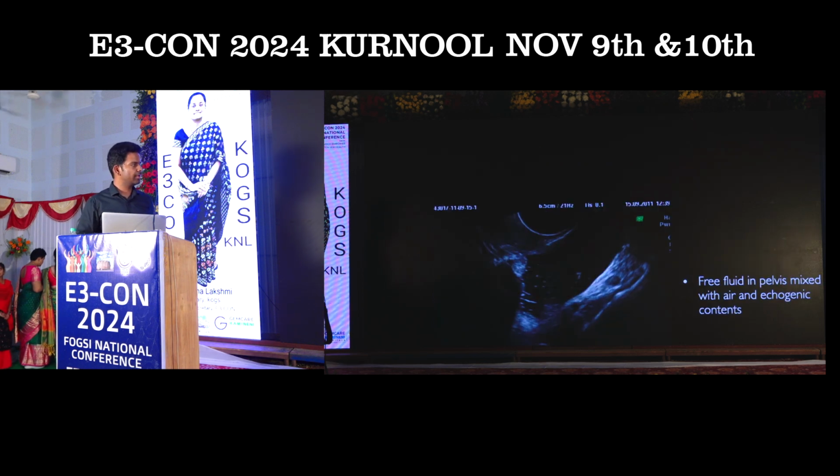Alternatively, we can also diagnose with the help of the presence of free fluid in the pelvis which is mixed with air. This will also point towards a patent tube.